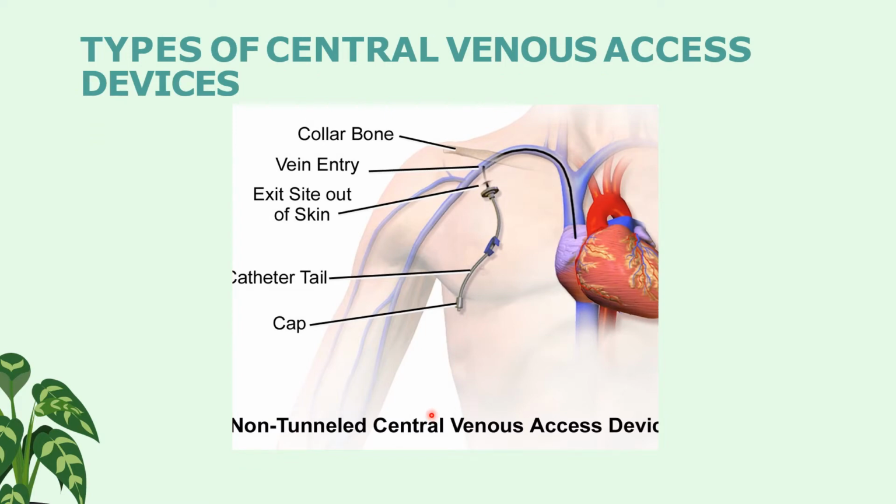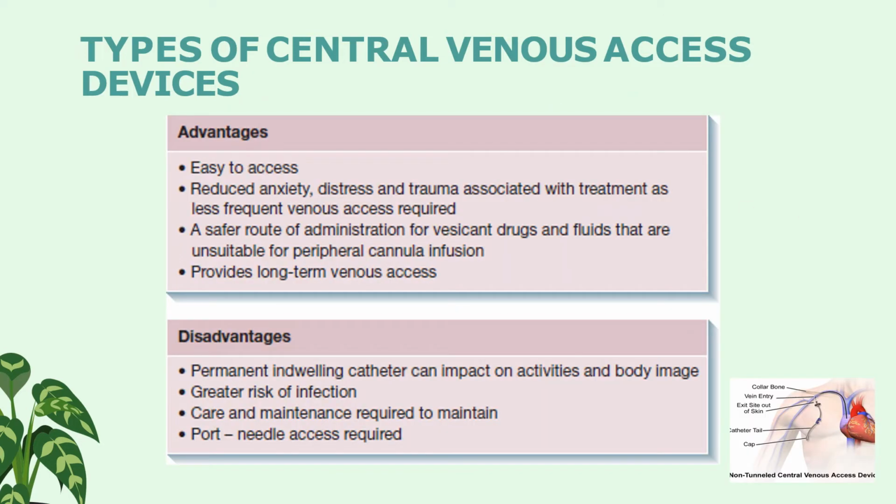So, another type of central venous access device is the non-tunneled central venous access device. So, as you can see in this image. There are advantages and disadvantages of using the non-tunneled central venous access device.